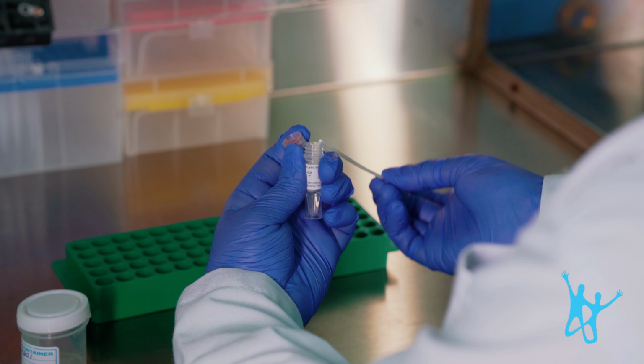Take the sterile swab and carefully rotate by dipping into the sputum sample collected in the container for 10 to 15 seconds. Insert the sampled swab into the vial containing quick lysis buffer and ensure that the absorbent tip of the swab is completely immersed in the buffer.